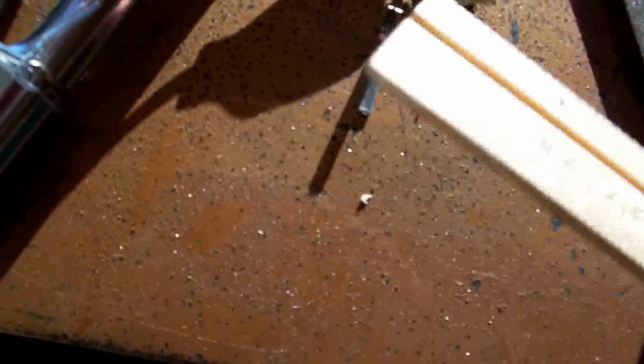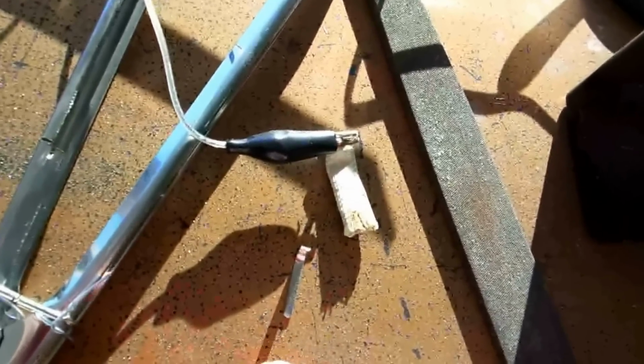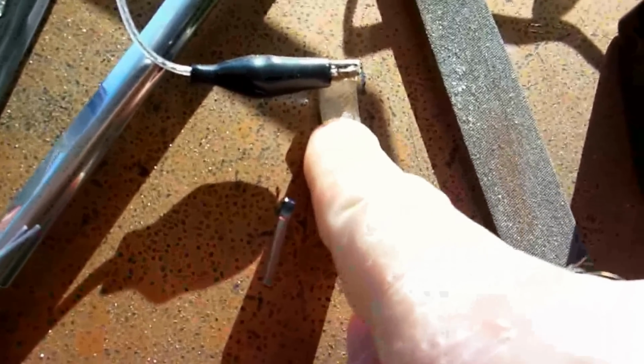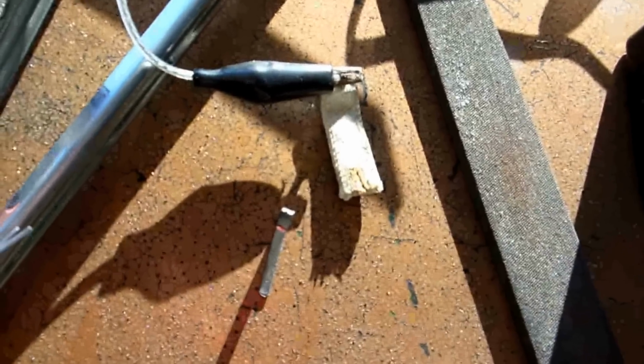These are just under an eighth of an inch. You can see right there, and the length is under an inch. So basically, when you check where your vein and artery is, you want to make sure it's in the right spot, and it's accurately getting to the blood, the main blood flow that's going through those main arteries, because it's going right along this little metal strip, and it's protected on the outside so you don't burn the skin by this cloth with some tap water, which is fine, or saline solution, and that's it.